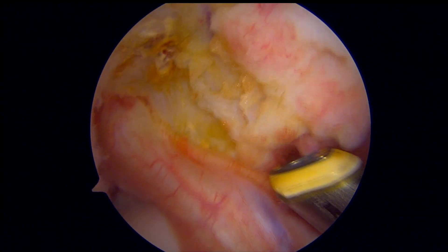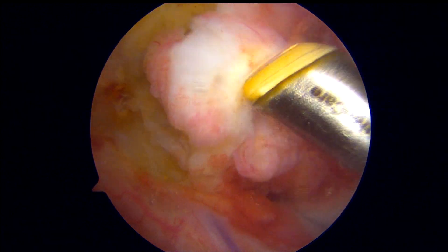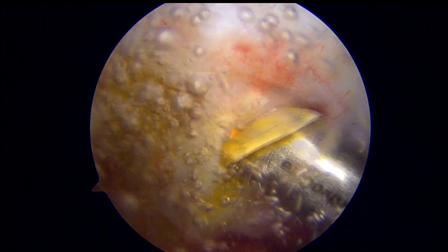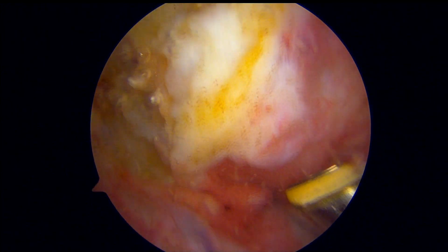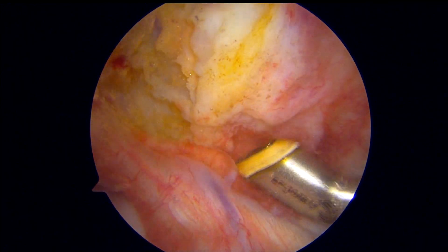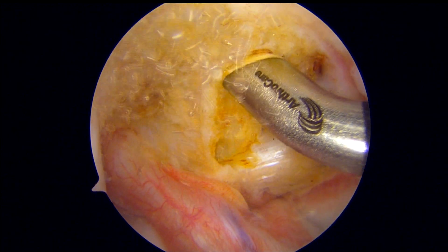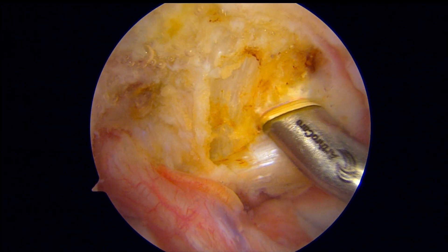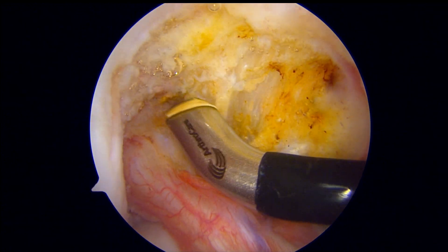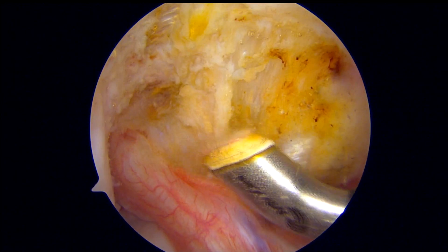Here is the intercondylar notch, where you can see the synovial tissue overlying the posterior cruciate ligament. We are using the ArthroCare wand to ablate and destroy the synovium to ensure an aggressive synovectomy, which helps prevent this disease process from continuing in the future.